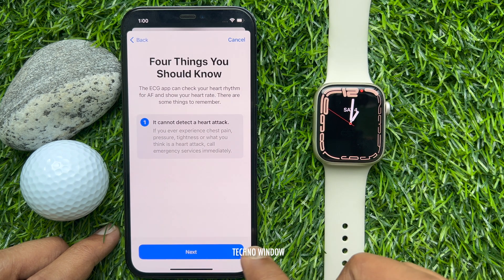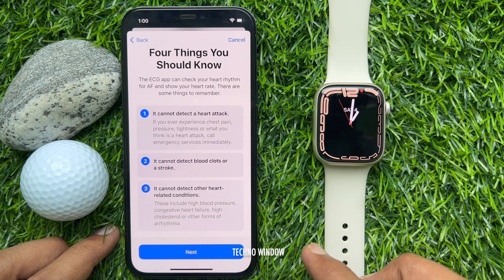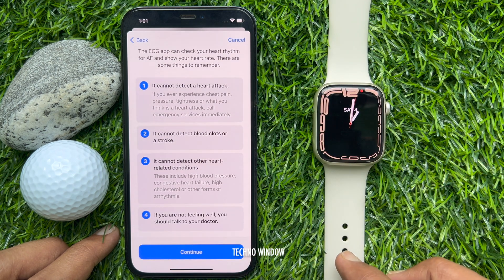Tap Next. Again tap Next. Tap Next one more time. Then tap Continue.